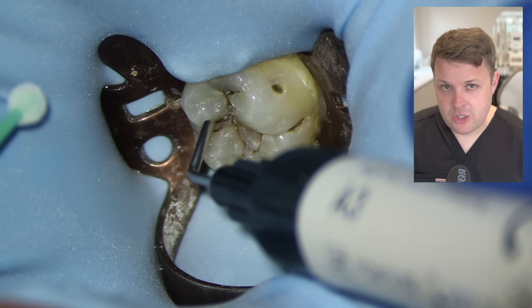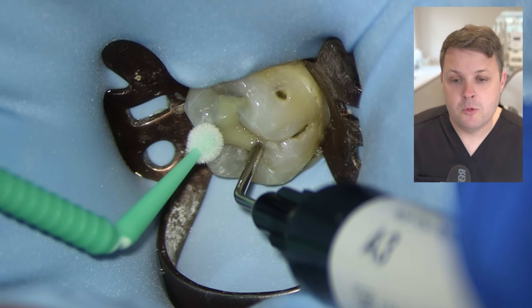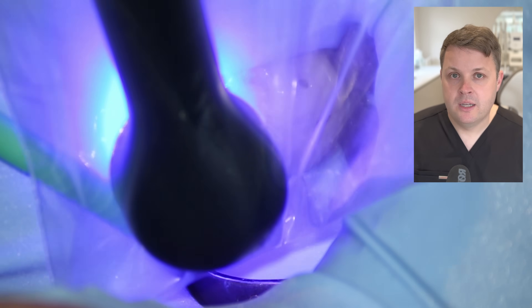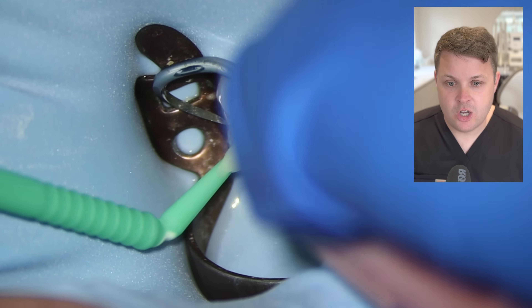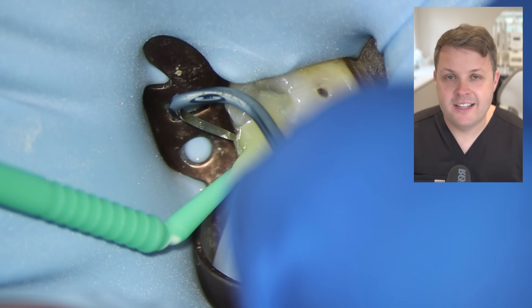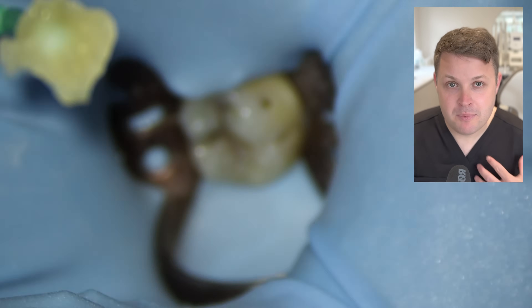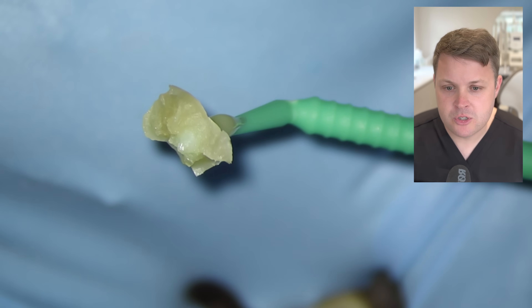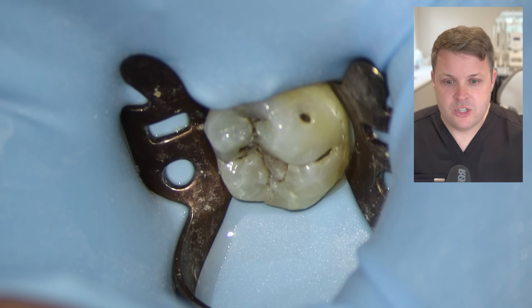In this case I'm going to use a stamp technique. Essentially, we're going to flow some flowable composite into the occlusal surfaces of the tooth just to capture the occlusal anatomy. At a later date we're going to use this to copy the occlusion of the tooth. We've made a nice copy of the occlusal surface with good occlusal anatomy, and that is placed away to use right at the end.